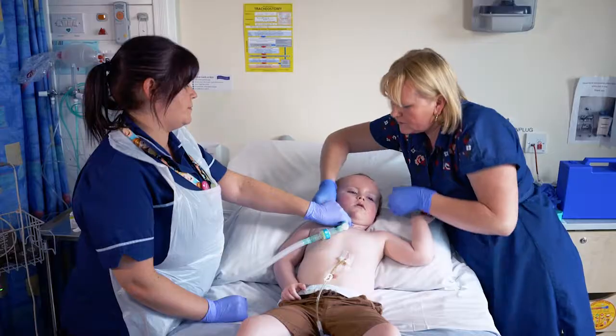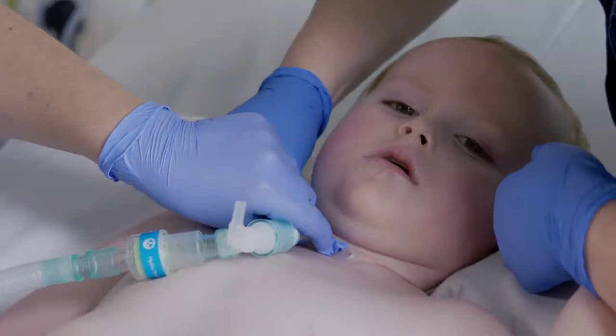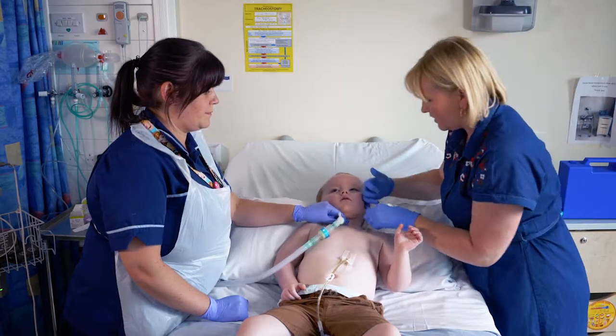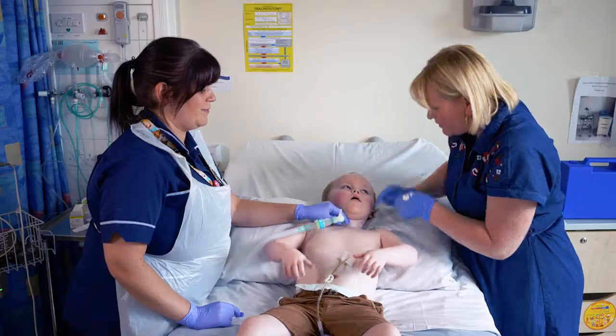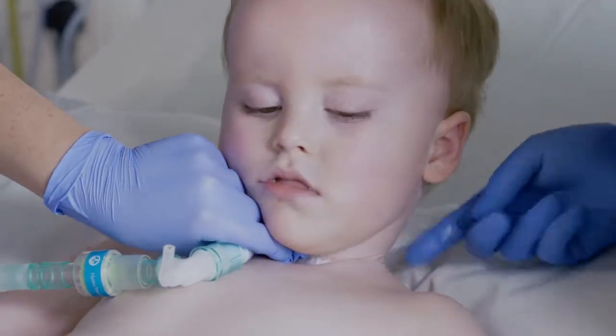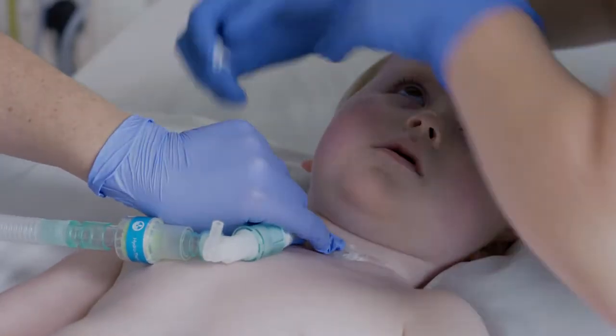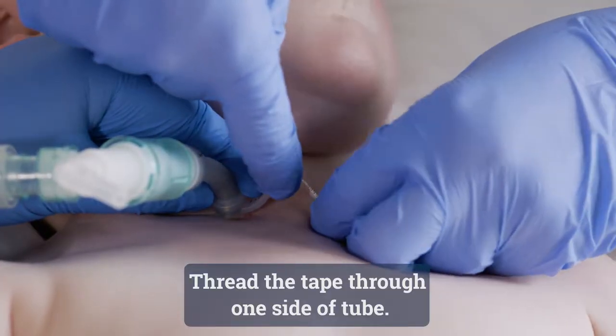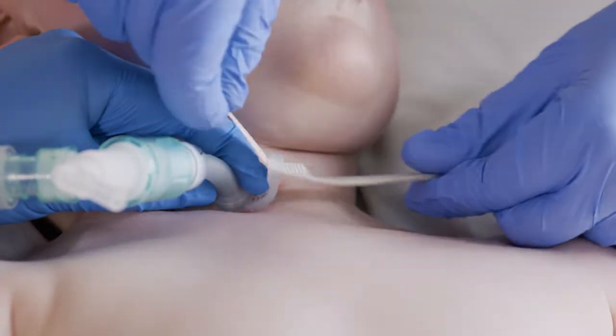Let's try that side. Iron cream. Put your head up. Good boy. No. No. No. Okay, yeah, pat him.